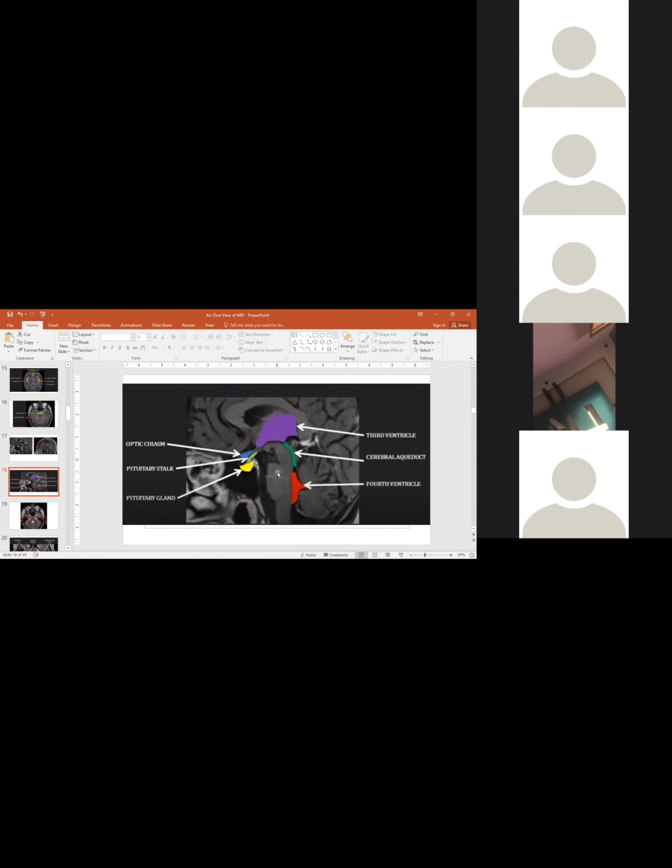This is the brainstem, and anterior to the brainstem, this is the pituitary gland, which occupies the pituitary fossa. So the pituitary gland is very important, and we usually report and see its integrity, whether it is normal or associated with some problems, pathologies or not. And we can also appreciate the pituitary stalk as well. So the pituitary stalk can be visualized on MRI examination.